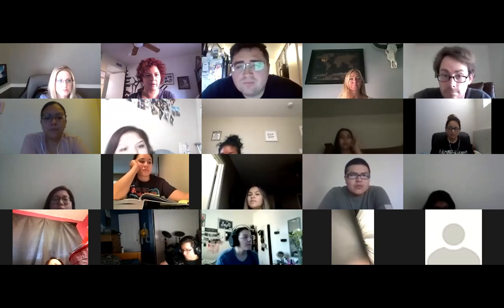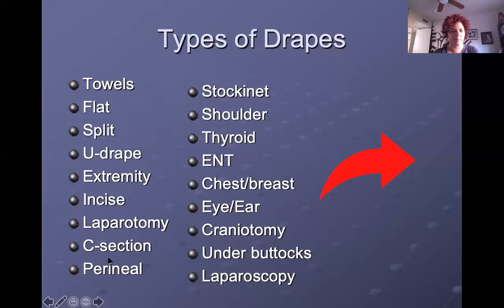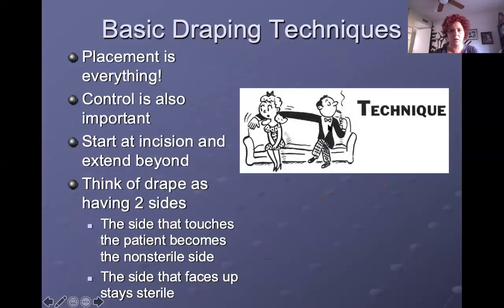Okay, I'm going to go back to my PowerPoint now. Okay, so let's just talk a little bit about draping techniques. The book kind of outlines some stuff for us as far as general practices. One of those being placement is everything, right? If we're going to be placing them, we're going to be handling them, we need to know what we're doing.